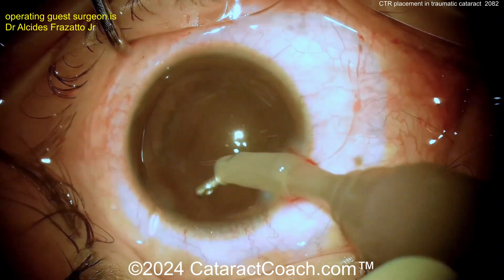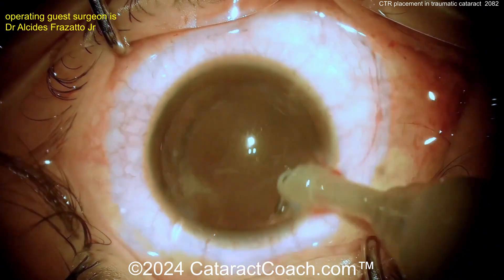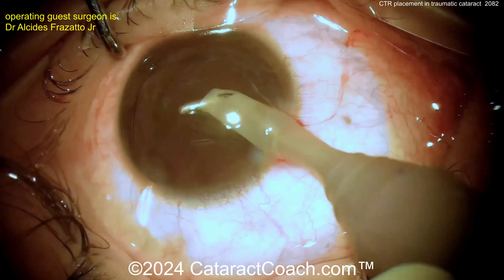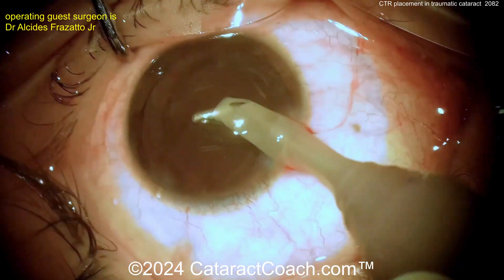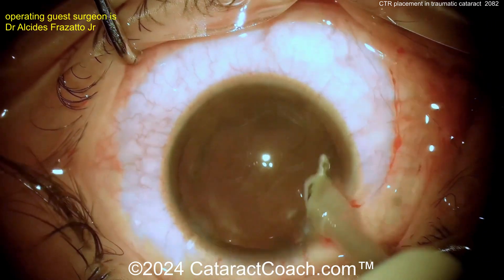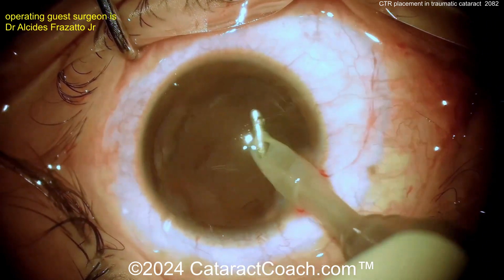For cortex removal with the CTR in, you're going to have to do more of a tangential or circumferential approach — not really a radial approach — in order to be efficient with that.